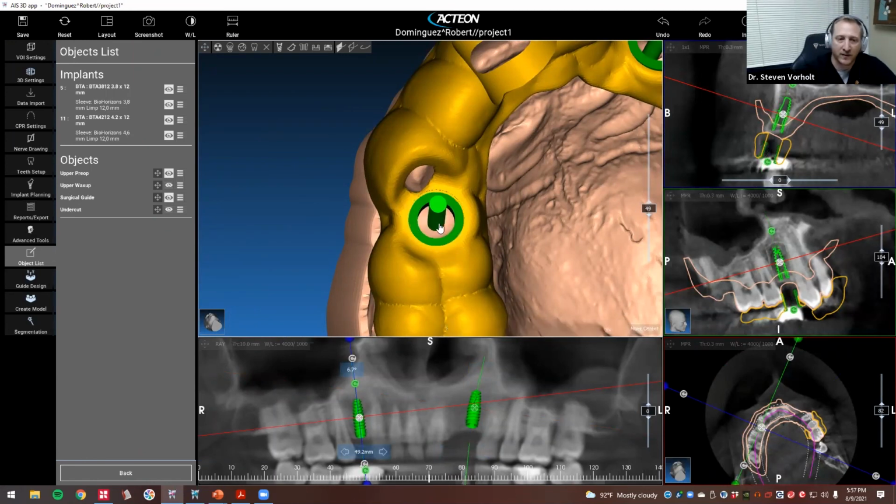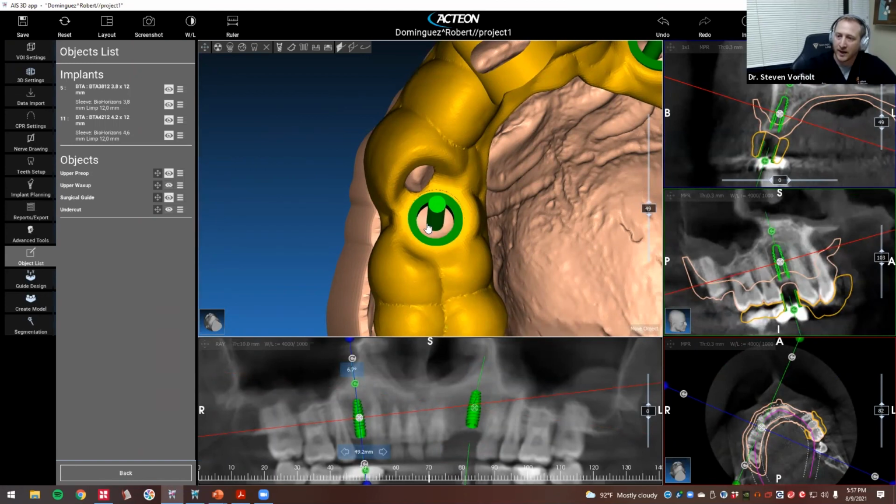I wasn't sure if I was going to place the implant through the guide at the end, so I was considering doing a 2.0 drill, the osteotomes, and then I might do the implant through the guide. So I wanted the fully guided sleeve available. But if that's not an option, yes, you could do a 2.0 or a pilot guide only. That would have a much, much smaller sleeve. Good questions.